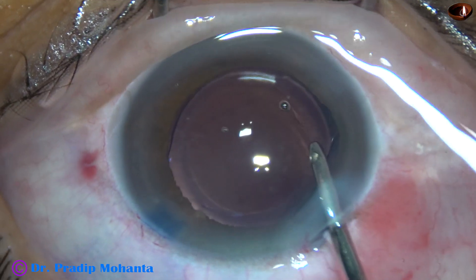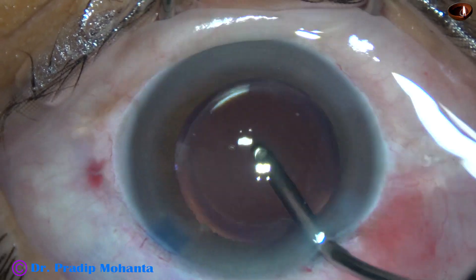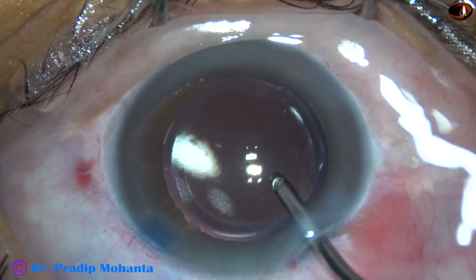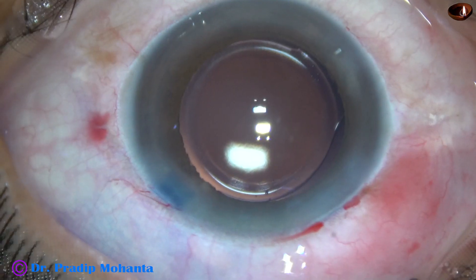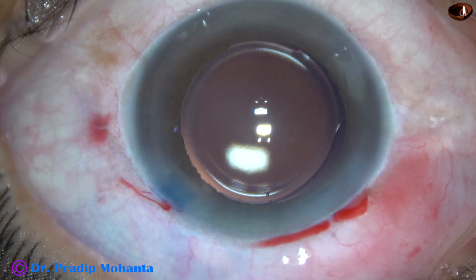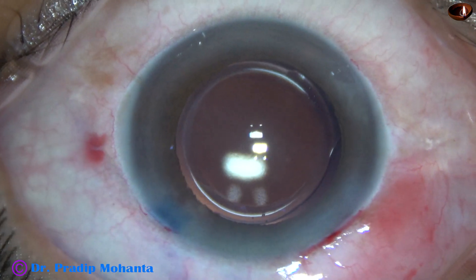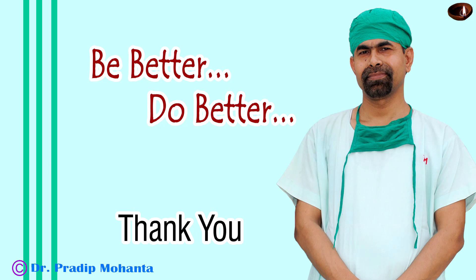The side ports are hydrated and closed by corneal stromal hydration. The anterior chamber is formed very nicely and the case is concluded. Thank you very much for your attention. I hope this video will help you in learning mini-rhexis followed by optimum-sized rhexis.